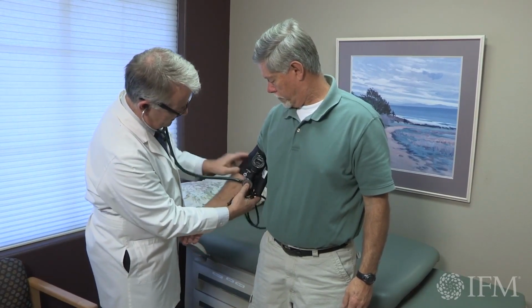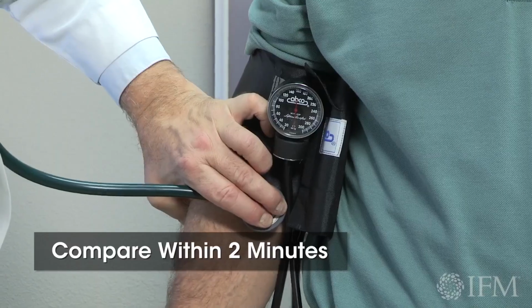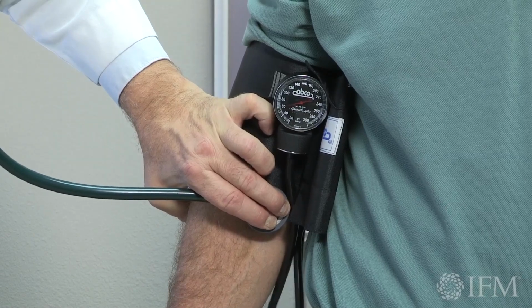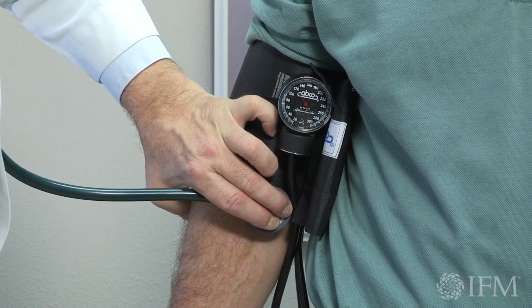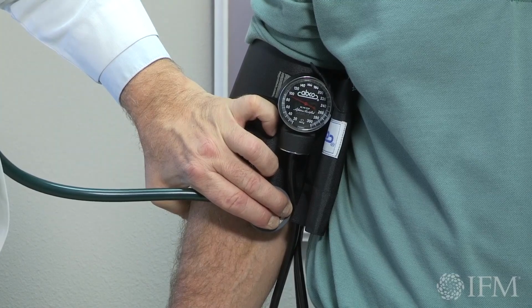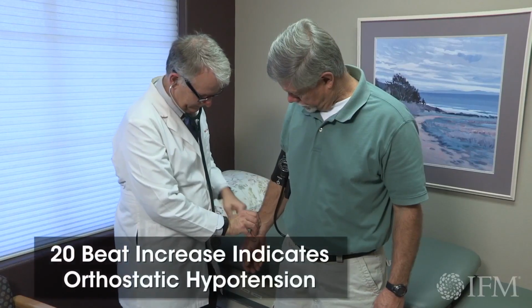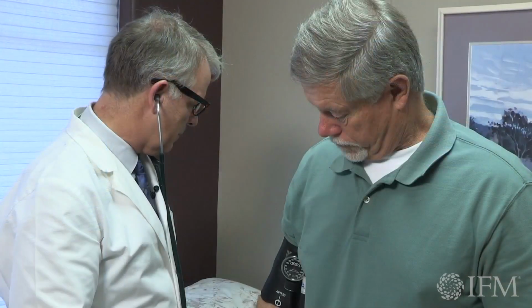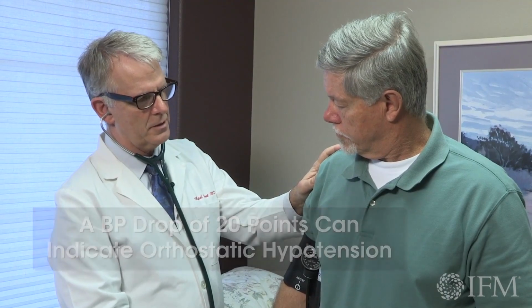And we're going to check this blood pressure here. You can just let your arm hang. Try to do this within 2 minutes of when you stand up. And what we're really interested in, are you feeling dizzy at all or lightheaded? Great. Okay, I feel your pulse here. Perfect. So your blood pressure didn't drop 20 points and your pulse didn't go up 20 beats per minute. So there's no sign that you are low in fluids or that your medications have an adverse effect for you.